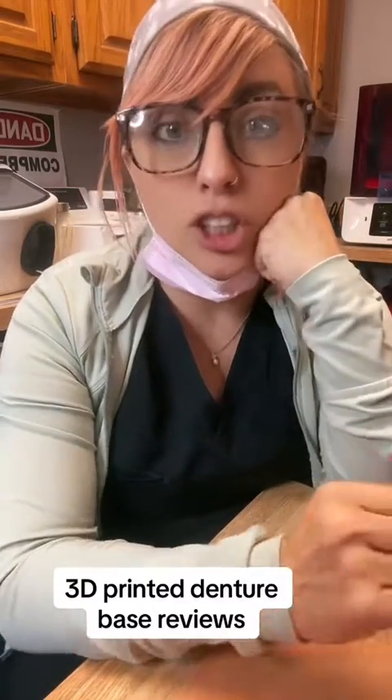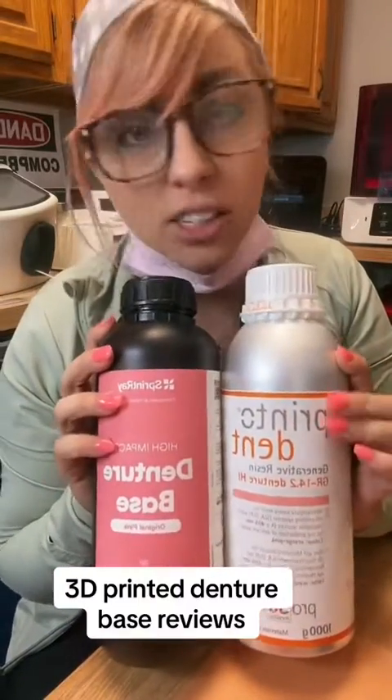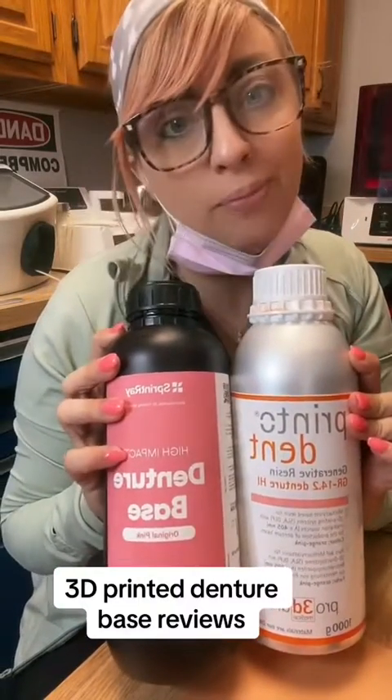If anyone asks my go-to resins for a denture, it's either one of these — I like all of them. Stay here and I'll do a review about denture teeth next.